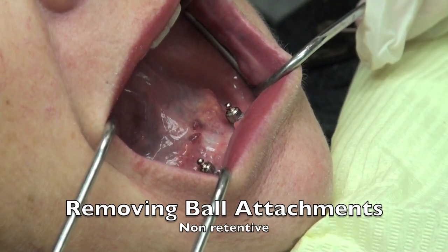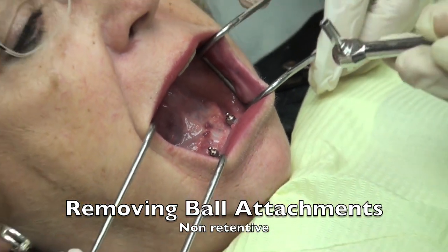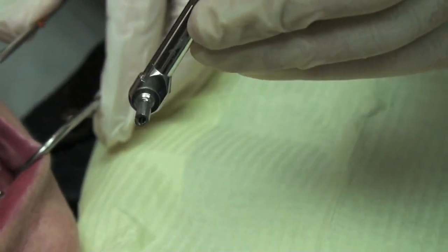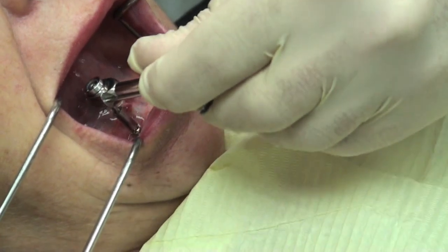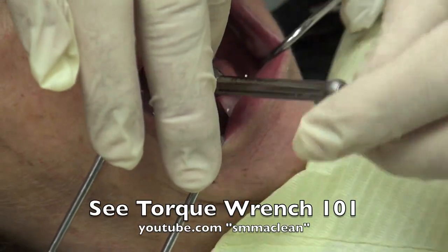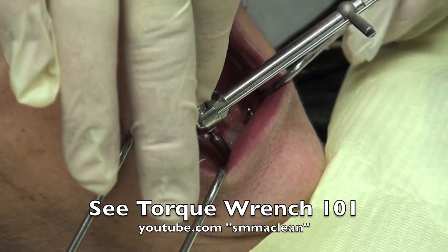Here this shows the two ball attachments and we're going to remove these with the torque wrench. There's an attachment you can add on to the torque wrench which snaps down on top of the ball attachment and enables you to easily remove this assembly.